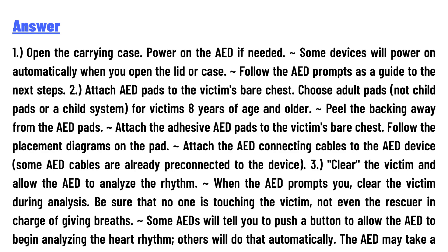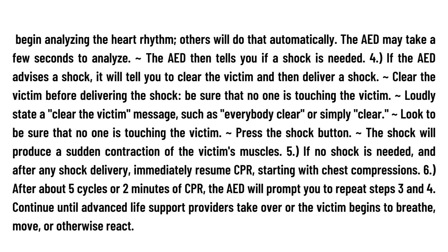During analysis, be sure that no one is touching the victim — not even the rescuer in charge of giving breaths. Some AEDs will tell you to push a button to allow the AED to begin analyzing the heart rhythm; others will do that automatically. The AED may take a few seconds to analyze, then it tells you if a shock is needed.